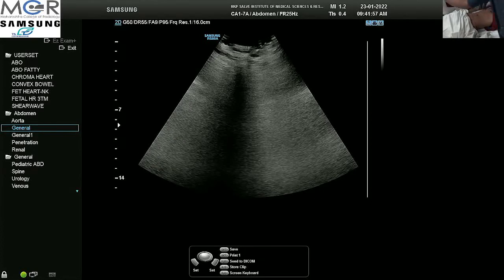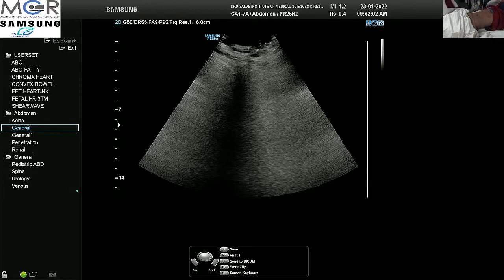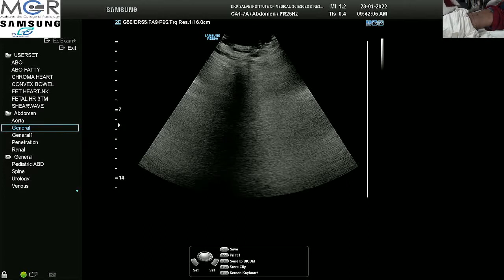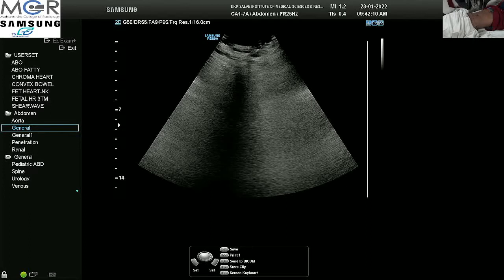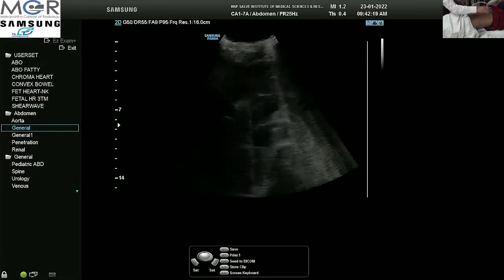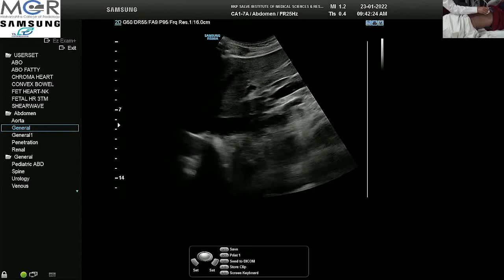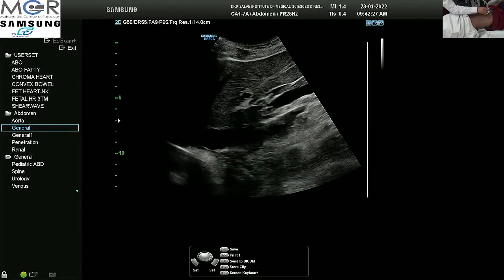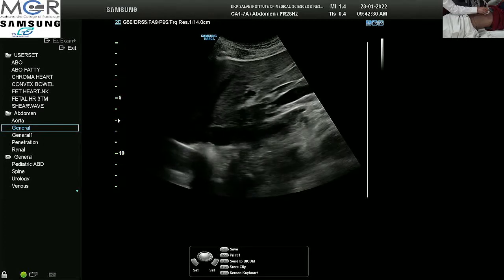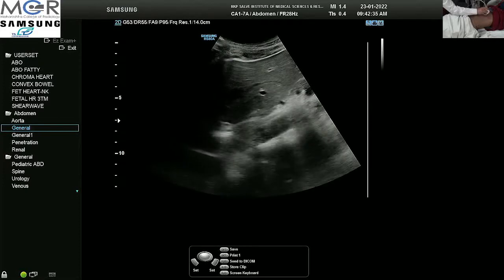Good morning everyone. I have a subject here who is quite lean, so I hope it will be easier to demonstrate the various parts of the hollow viscera within the abdomen. Let me first start with a convex probe. I am taking a convex probe and putting it in the mid sagittal plane in the epigastrium. I will increase the depth and then slightly rotate the probe towards the left side of the patient to see the gastroesophageal junction.